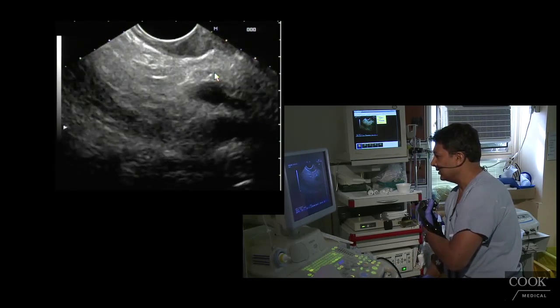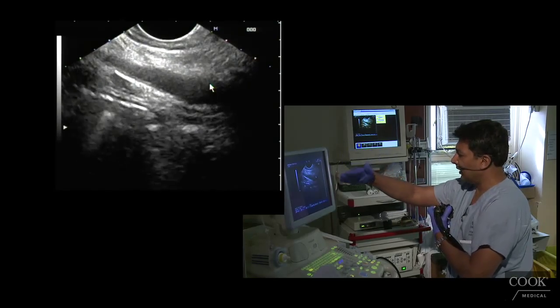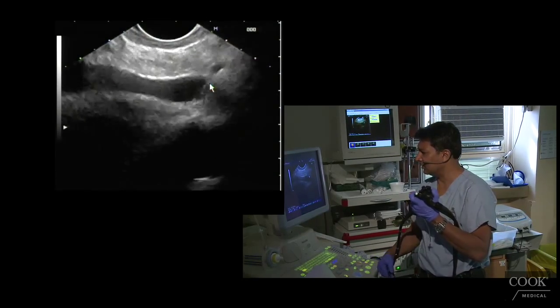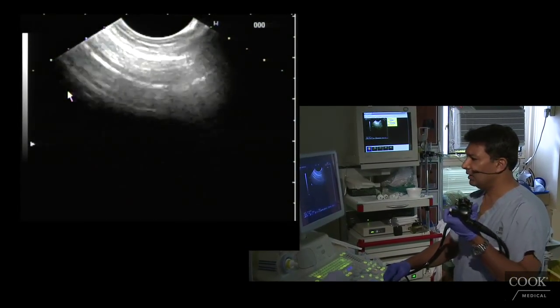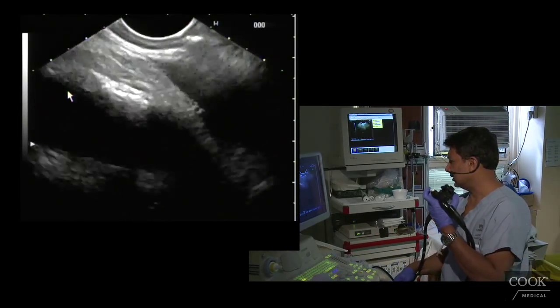And in this view, what happens is the PD goes around the genu, and the bile duct comes back and then goes into the screen up into the liver, and that's it. So I'm not seeing any stricture or anything. I don't know what we saw last time, but it just looks like basically chronic pancreatitis. So I want to look at the stricture now. So the PD here, to make sure you're not going into the fundus, okay?